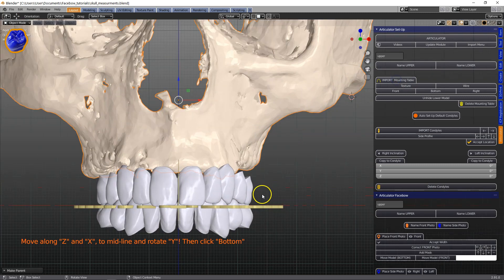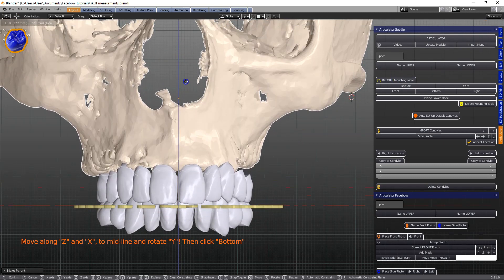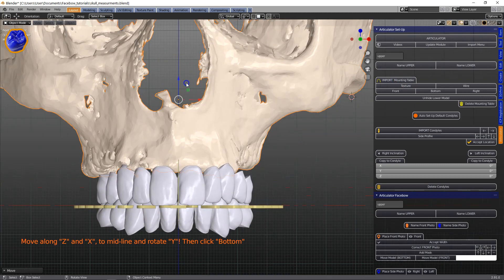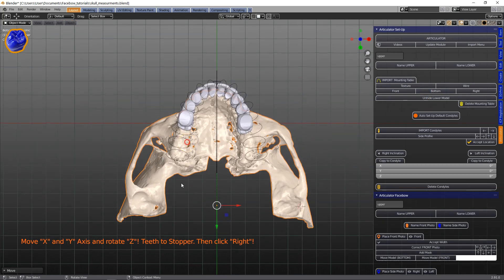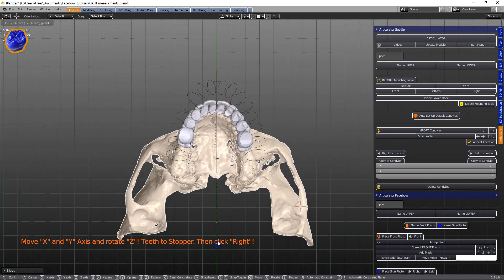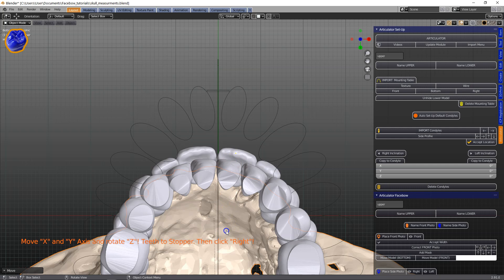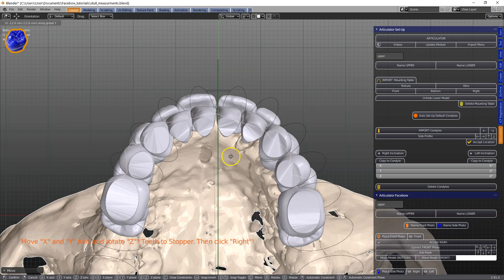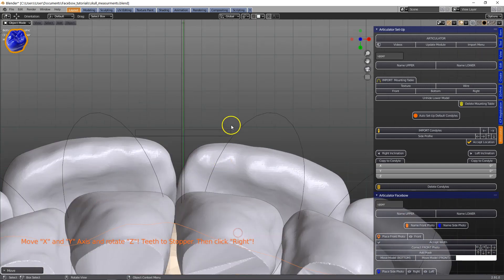Then we're going to import the mounting table, and as you see the other teeth and objects move with it. From below, I want to grab this and move it to the stopper — the stopper being this little platform over here.